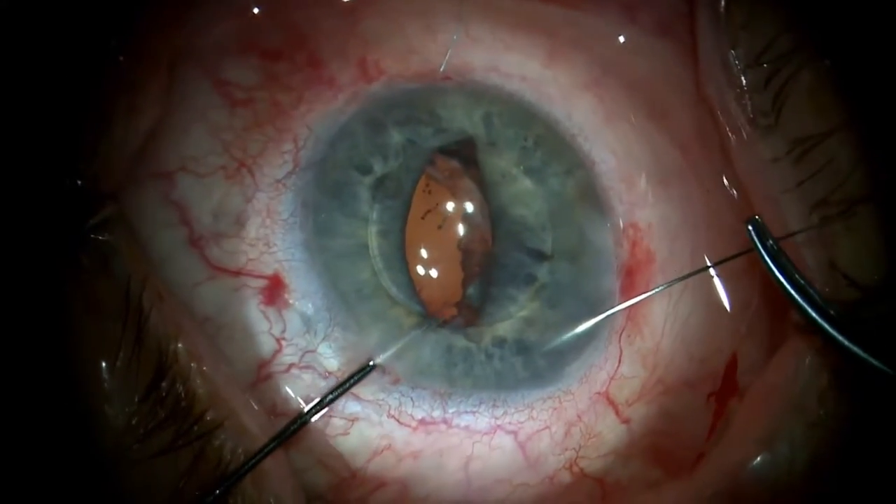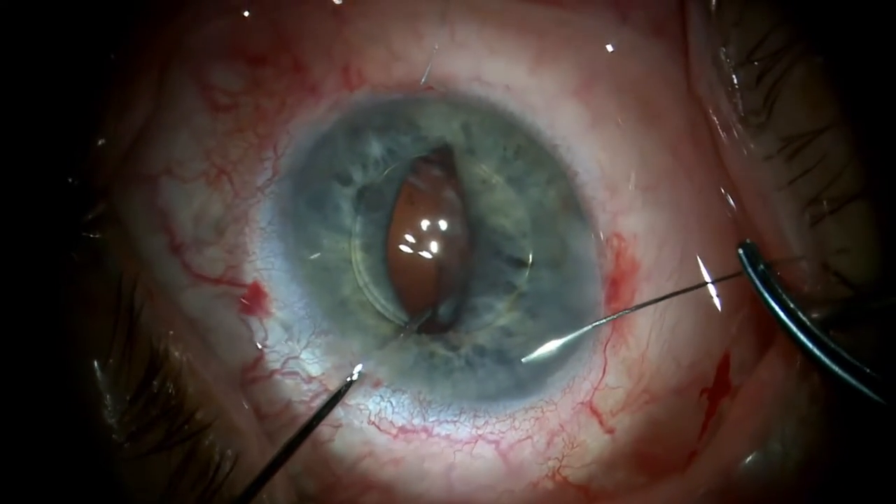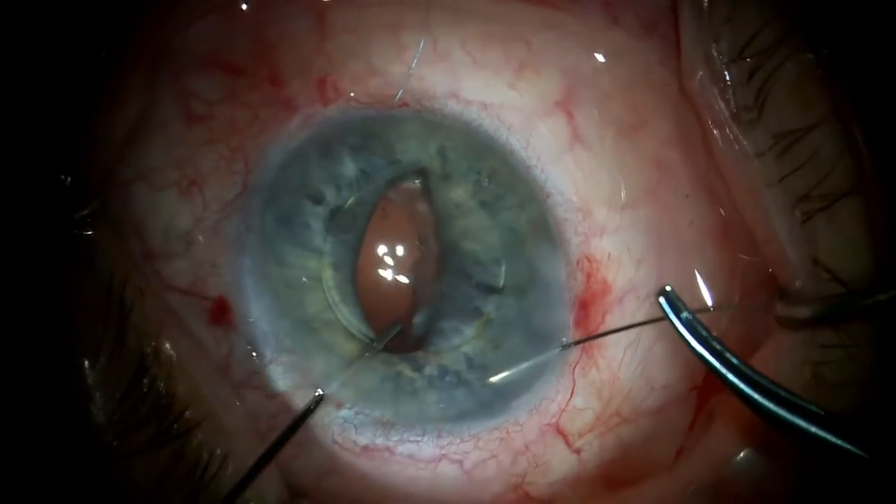The straight IOL manipulator supports the optic while the second needle is passed down through the iris, under the other haptic, then up through the iris and out through the limbus.